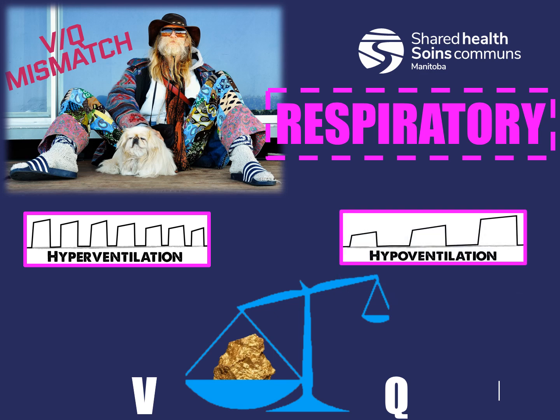Hypoventilation is a decreased respiratory rate leading to CO2 retention. This leads to a higher end tidal CO2 number. Waveforms begin to grow in amplitude, reflecting CO2 retention, and lengthen due to prolonged pauses. There's a decreased respiratory rate and a decreased tidal volume.